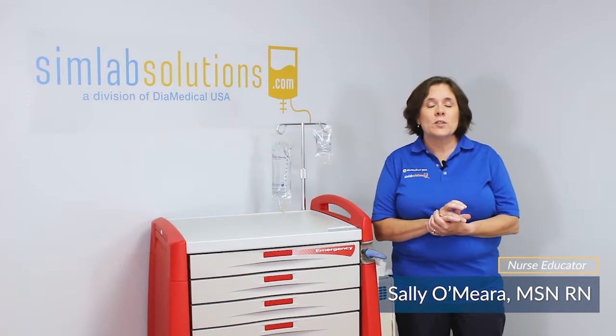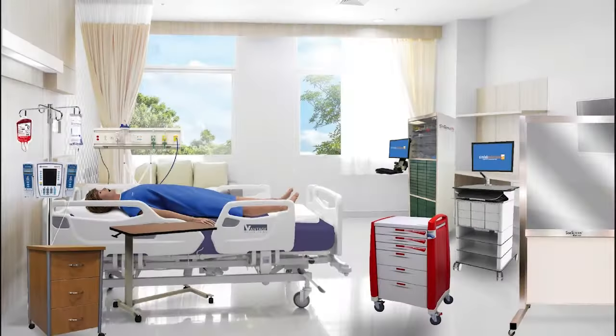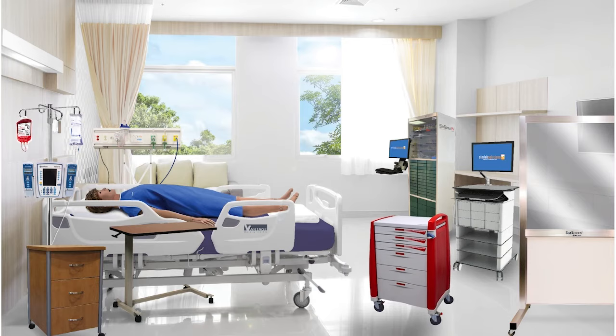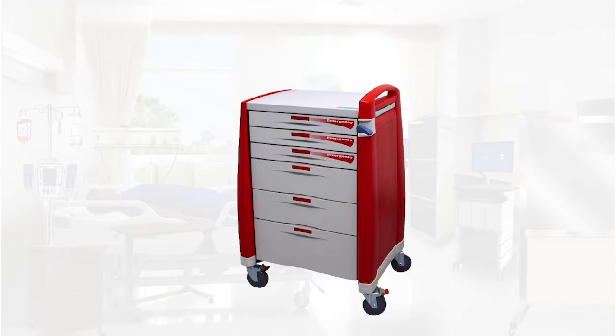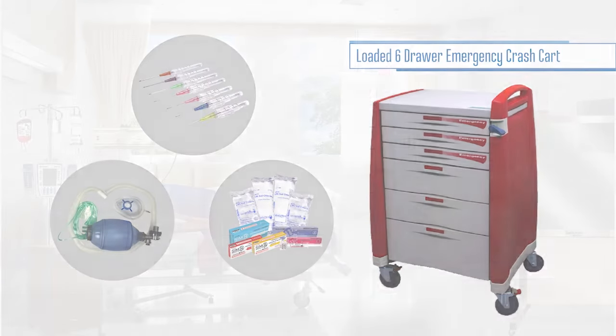Today I'll be demonstrating the basic use and overview of our loaded six drawer emergency crash cart. The SimLab Solutions six drawer emergency crash cart is a hospital-grade medical cart that is filled with simulated medications, equipment, and emergency medical supplies.